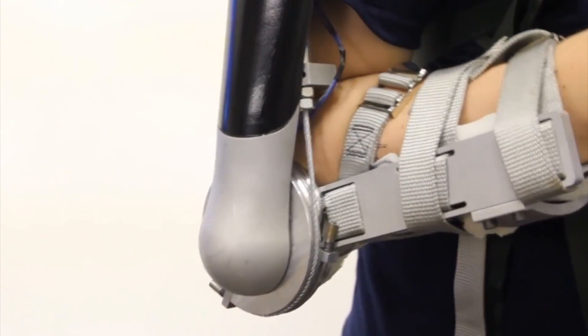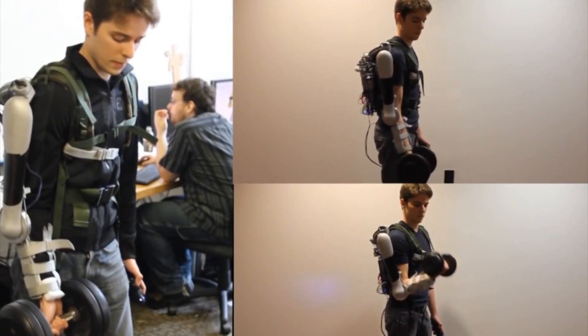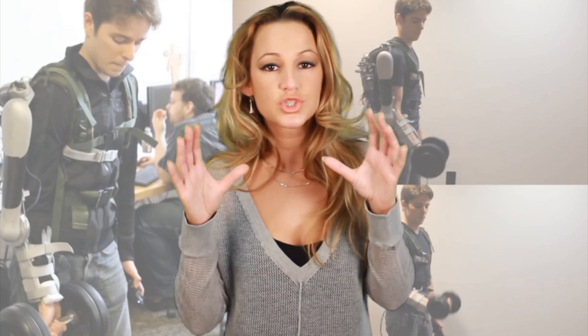This device can help the wearer lift an additional 40 pounds. It's equivalent to the weight of a 4-year-old child. So imagine picking up a 4-year-old child, but it feels like you're picking up a teacup.